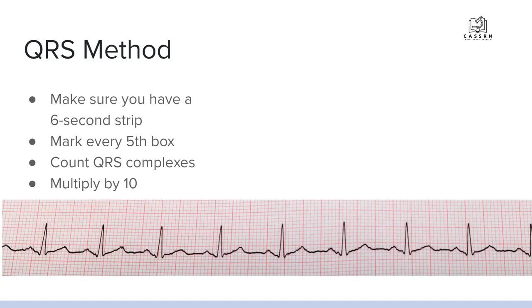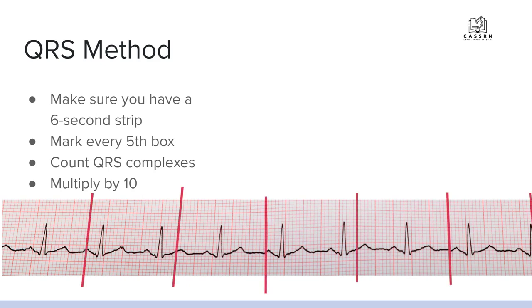Here we have a strip cut to six seconds. We count every five small boxes to mark one-second intervals — five boxes equals one second — going through until we have six one-second intervals marked on the strip. Each space between the lines counts as one second because there are five blocks in between each line.